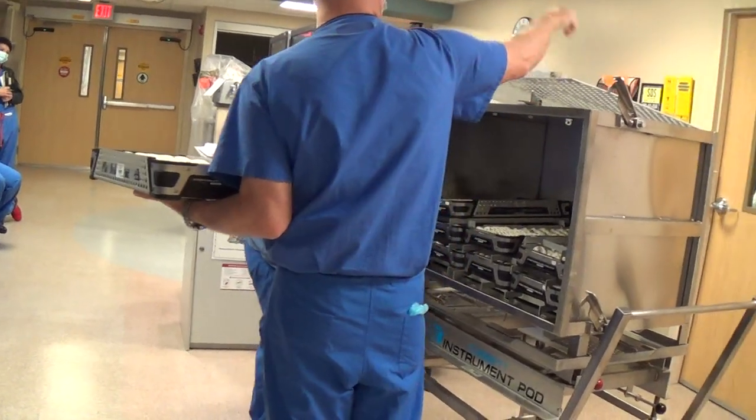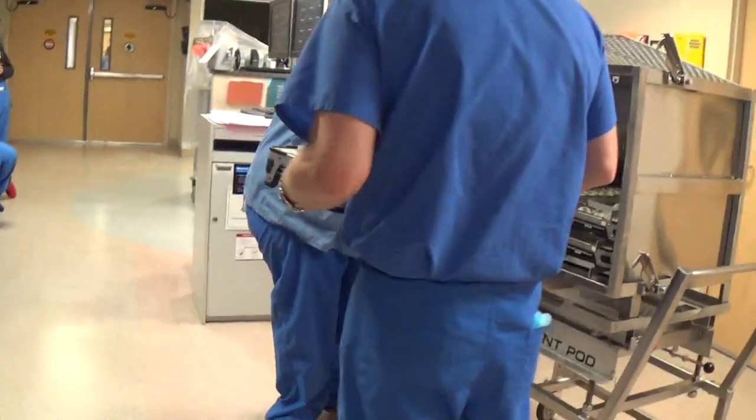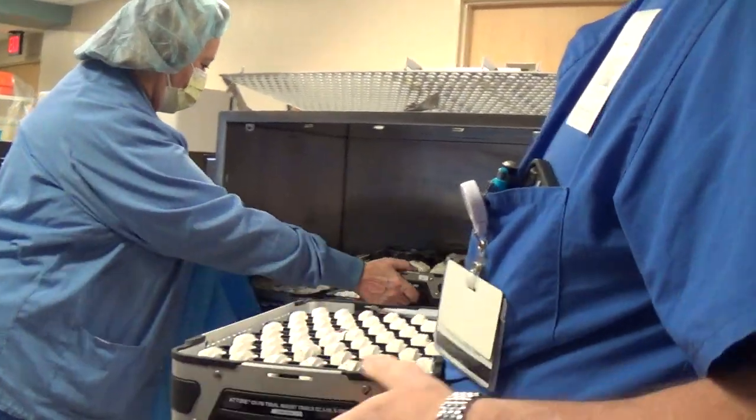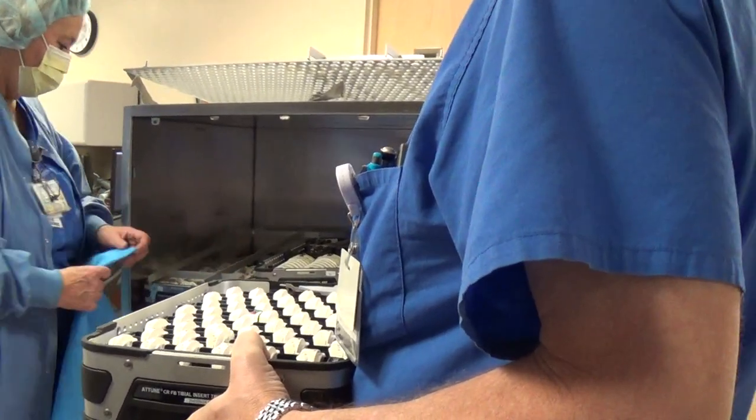These little separators drop up top. So you can put an entire case in here — you can put your retractor tray, everything. We can put drills in this as well.